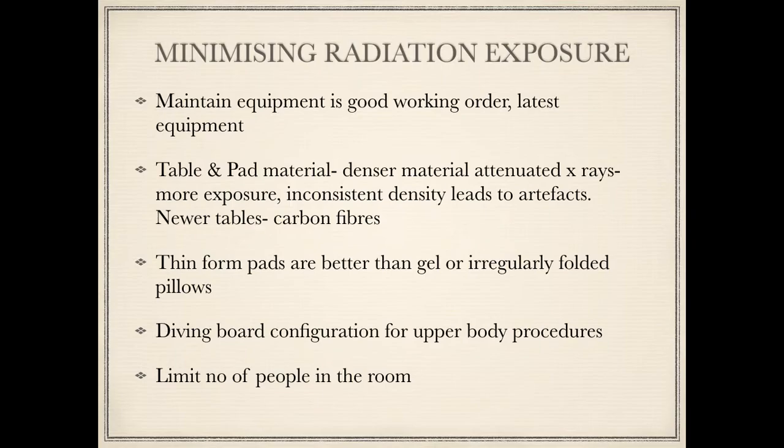Sometimes we use what is called a diving board configuration. If you're doing a cervical spine procedure, it's not uncommon to see a wooden board extending beyond the edge of the table, on which just the head end of the patient is lying. Because the wooden board is thinner and the consistency is different, the X-ray beams don't have to travel through the thick table, and this minimizes your radiation exposure as well. And the obvious thing to minimize the radiation exposure is to have fewer people in the room. Whoever is not required should not be in the room.